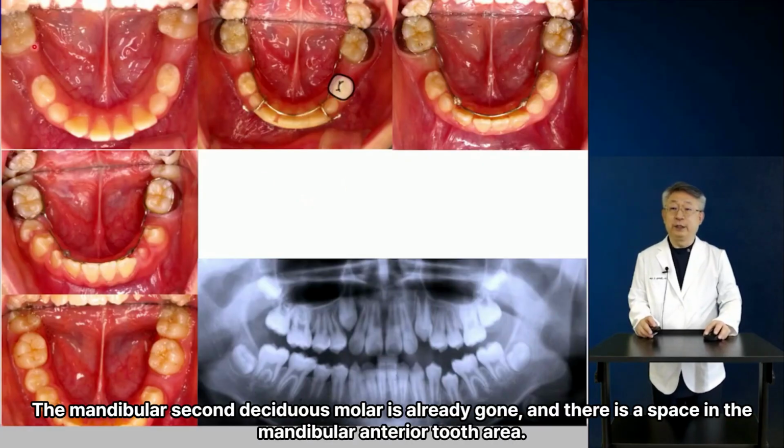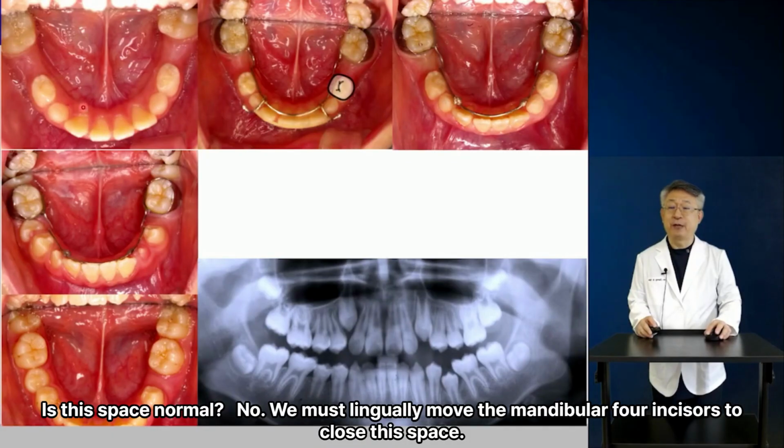The mandibular second deciduous molar is already gone, and there is a space in the mandibular anterior tooth area. Is this space normal? No. We must lingually move the mandibular 4 incisors to close this space.